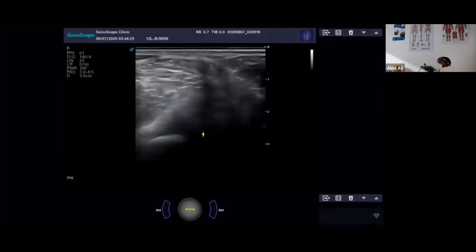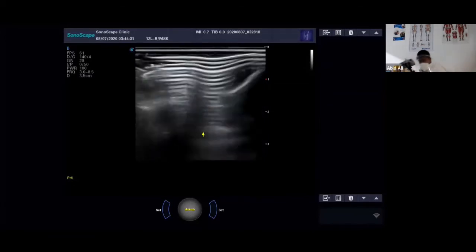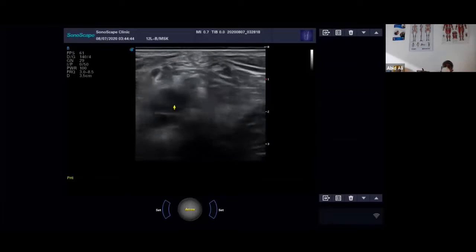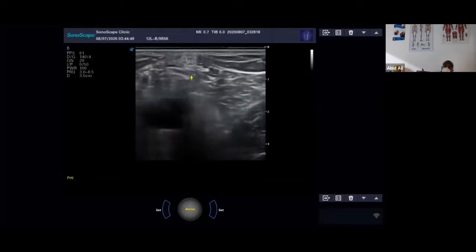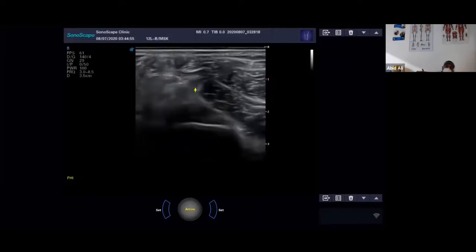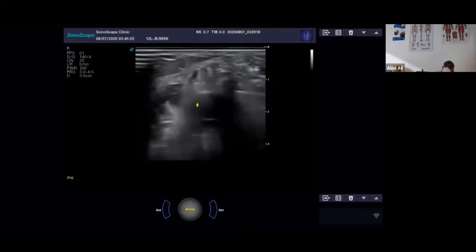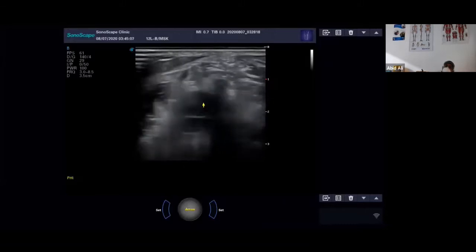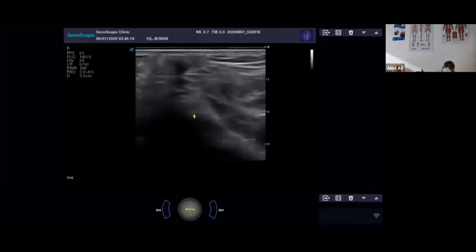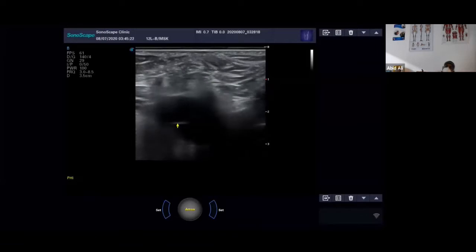The other knee. That was the other knee, yeah. There we go. Do you want to see that from the posterior aspect? Yeah, let's. I'll go that way. So there's the cyst there. So there's the cyst there. Here's the semimembranosus tendon. If you follow it down, you see way past the cyst now. And there's the medial head of gastroc, and there's that C position here. You can see that's where you find the Baker's cyst. So it's a bit more superior and medial, the cyst, is where you find the Baker's cyst. Yeah, and you can see that little septation there going through.